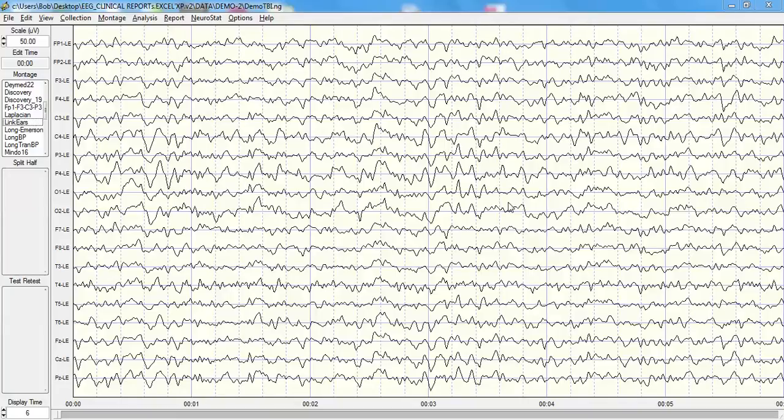The clinician does a clinical evaluation, does a clinical history, and provides whatever tests are necessary to assess the clinical status of the patient, with neuropsychological tests or whatever tests are appropriate, to determine the severity and nature of the symptoms. The clinician then records approximately 5 minutes of eyes open EEG and 5 minutes of eyes closed EEG, and then saves that data.